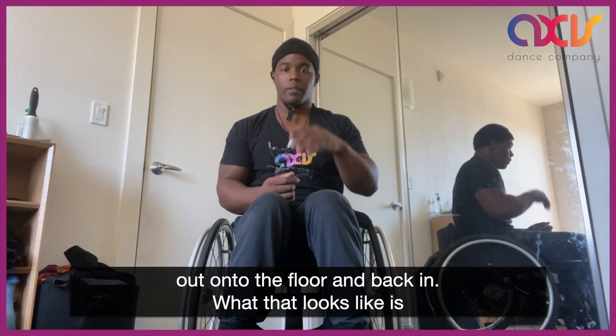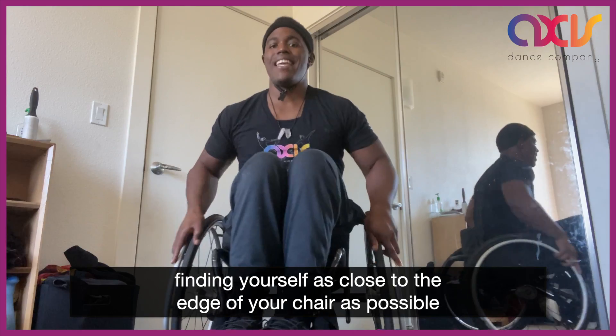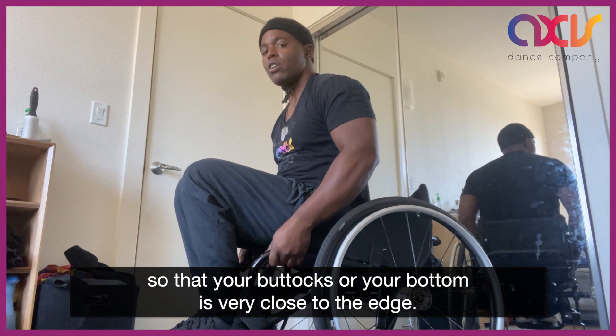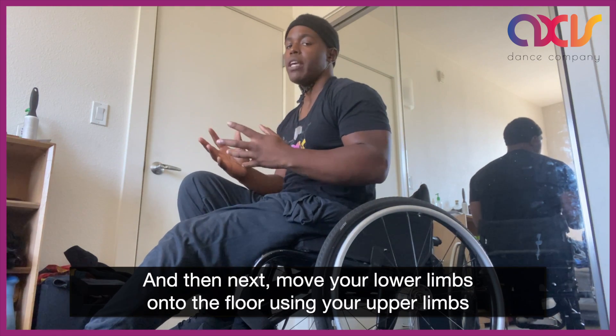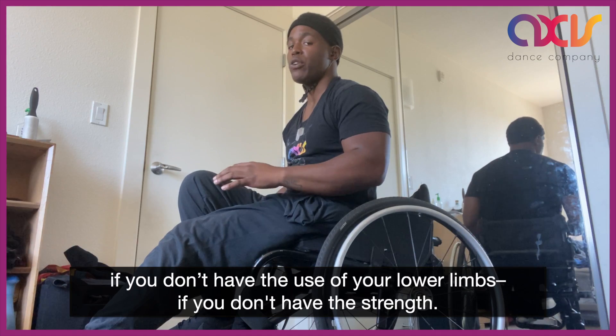What that looks like is finding yourself as close to the edge of your chair as possible so that your buttocks or your bottom is very close to the edge, and then next move your lower limbs onto the floor using your upper limbs if you don't have the use of your lower limbs or if you don't have the strength.